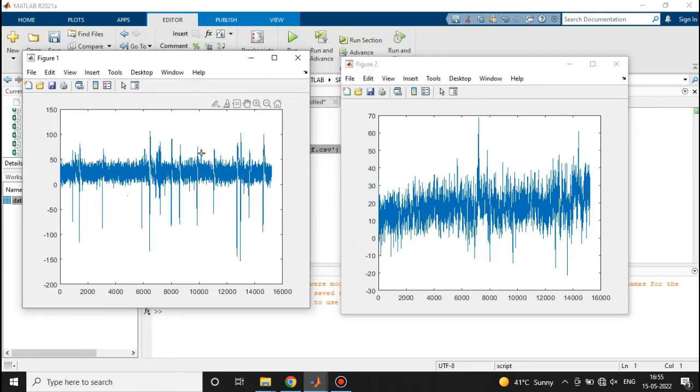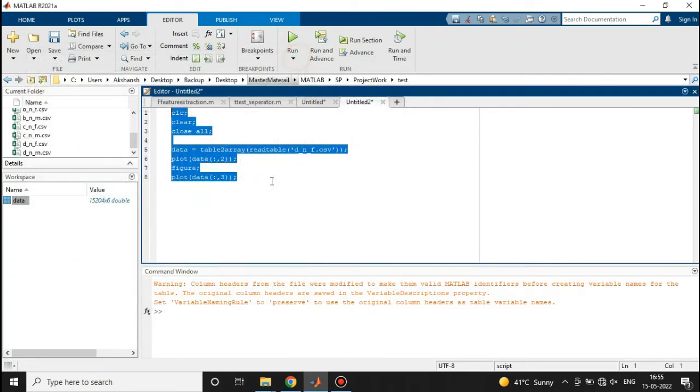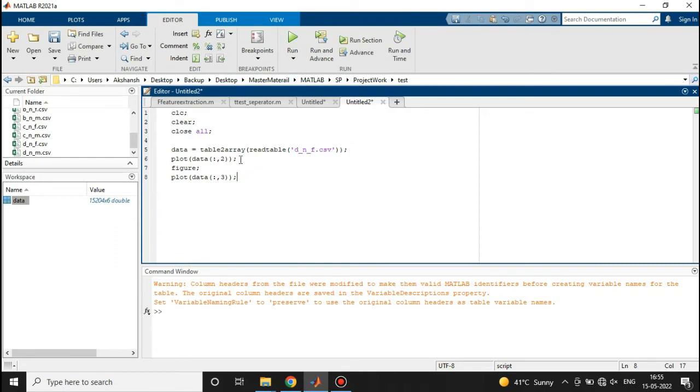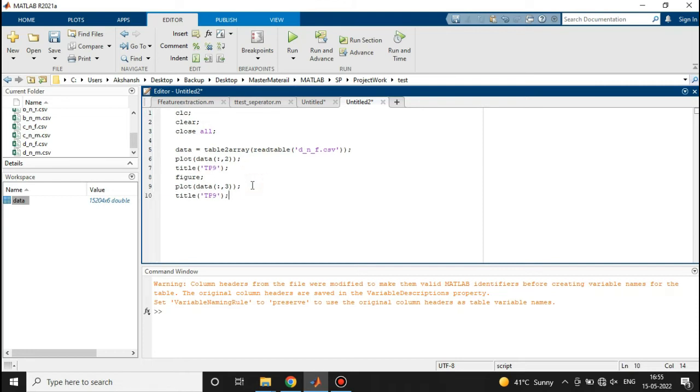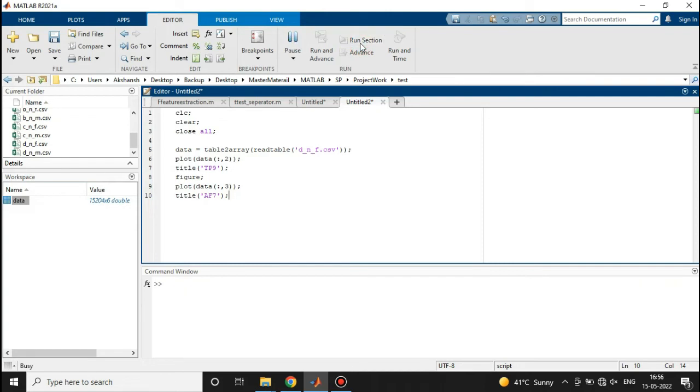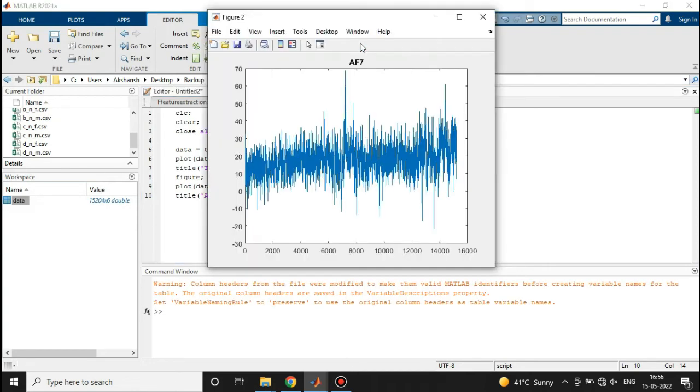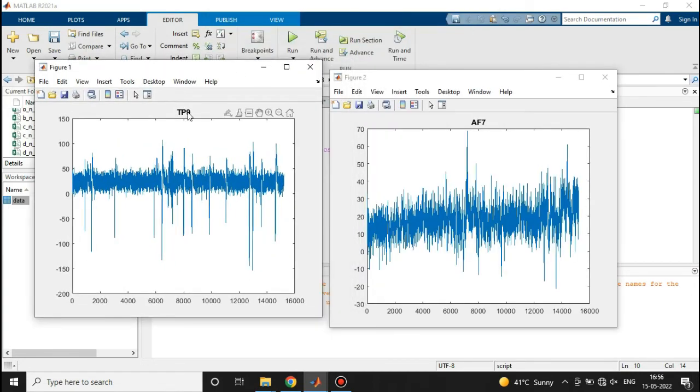We can provide the title also here. This one was TP9, and the next one was AF7. Now we'll run the program again, and here we go. So now you can see that we have a title here also - TP9 is this one and AF7 is this one. These are the EEG signals that we have plotted.